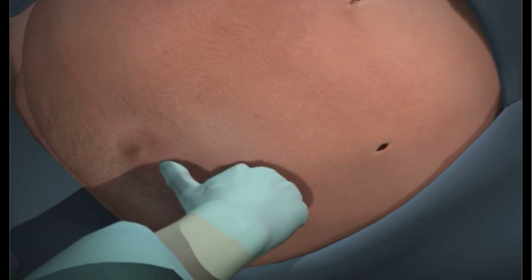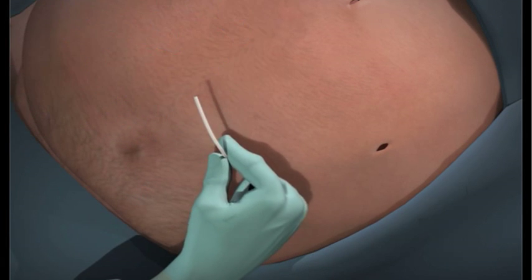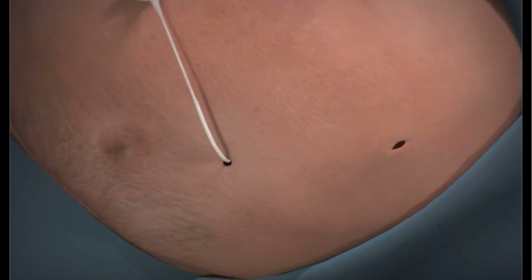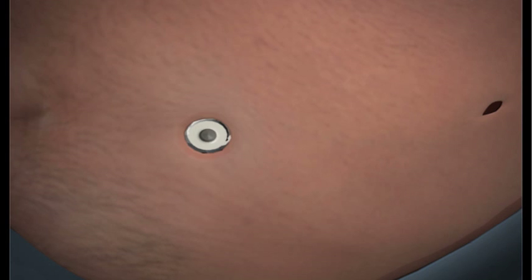After the band is secure around your stomach, the remaining part of the tube is pulled through a cannula so the end of the tube is outside your abdominal cavity. Finally, the surgeon attaches a port to the tube and secures it to a layer of muscle on top of the abdomen but beneath the skin.